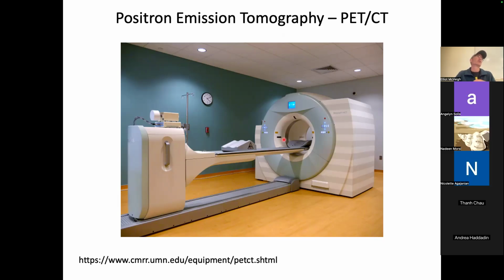And this is to, again, compute what the attenuation correction should be. So given a pathway out of a patient, how much tissue does the photon have to get through to get to the detector? And that will vary a lot depending on which pathway we're looking at. And so we want to include that in the reconstruction. So that map is constructed using CT data, right?